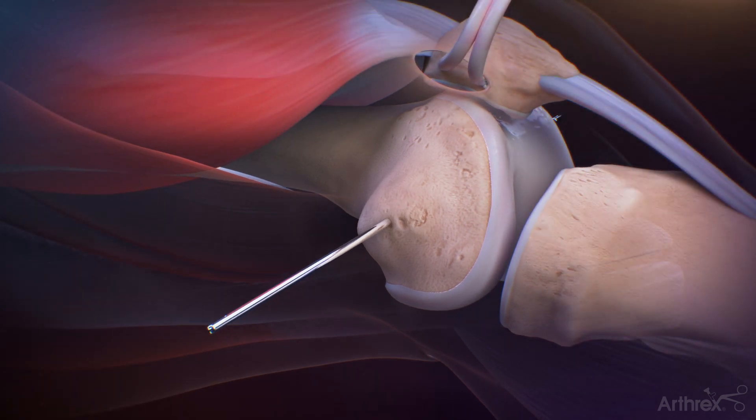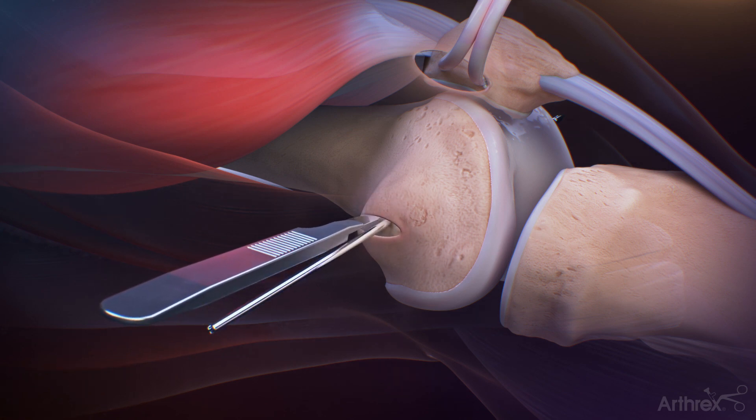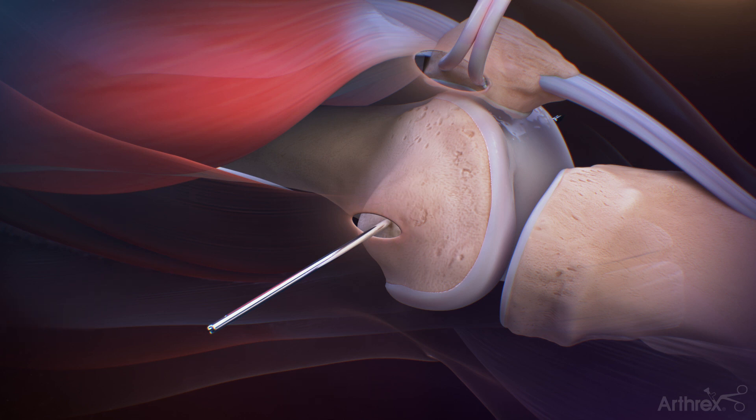Identify the space between the vastus medialis and the capsule and bluntly dissect towards the femoral insertion area with a scissor, leaving the capsule intact. A 1 cm longitudinal incision is made at the level of the 2.4 mm guide pin.